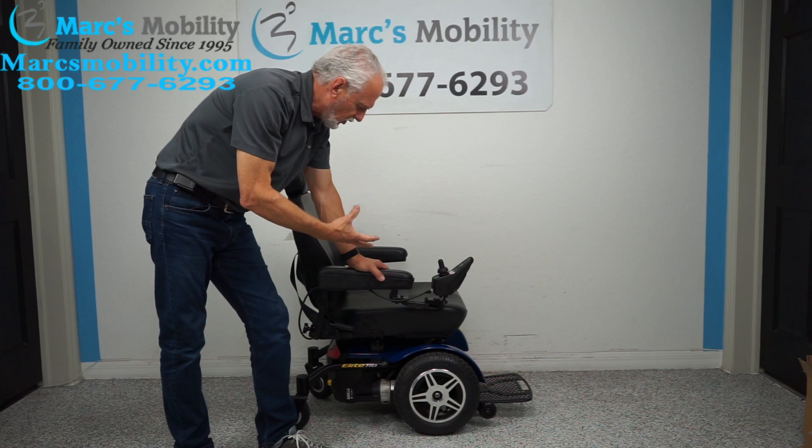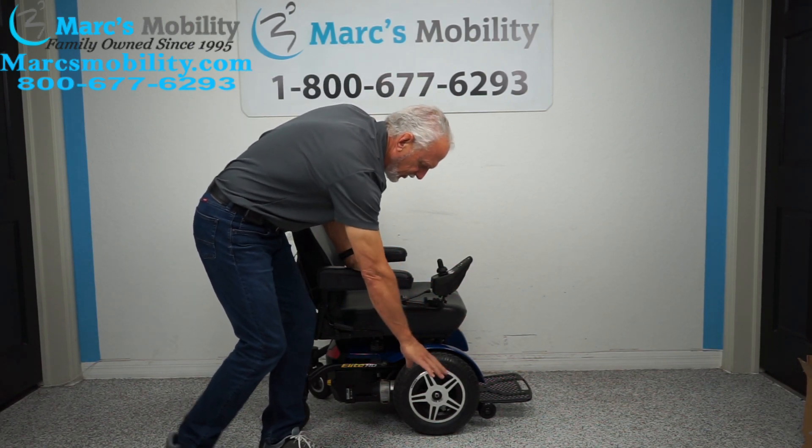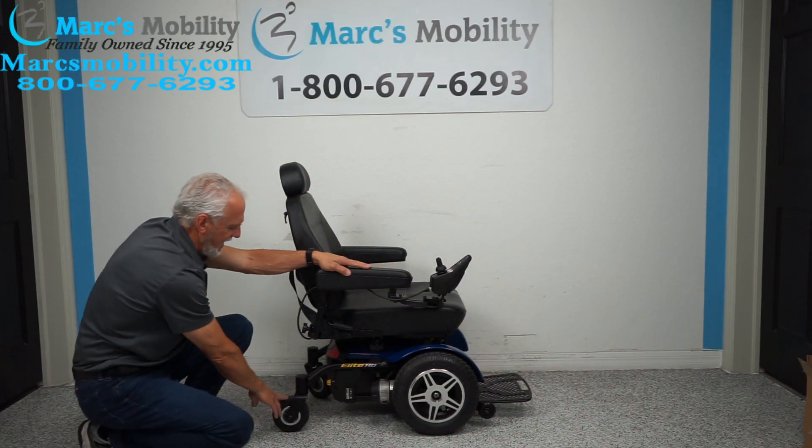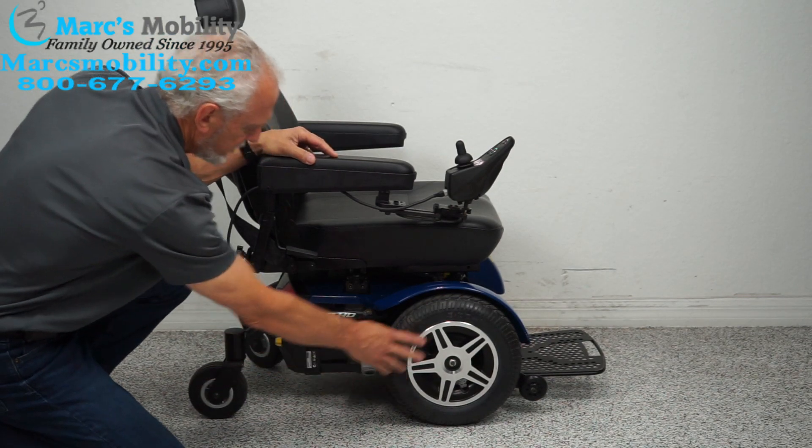It does have an extra large seat. It has 14 inch solid tires in the front — they are not going to mark your floor. In the back we have caster wheels, and there is a motor for each wheel.